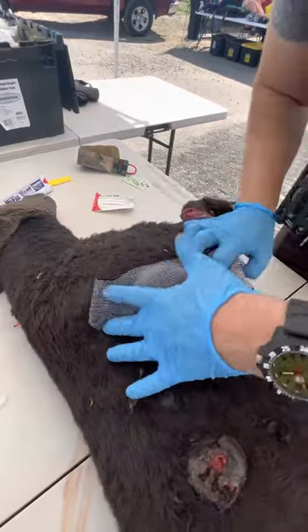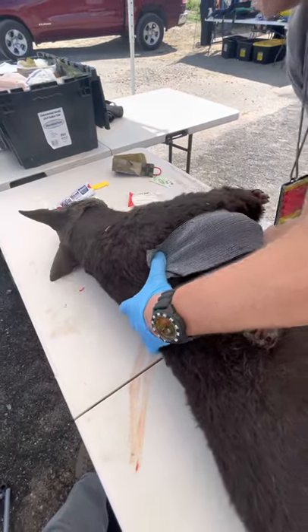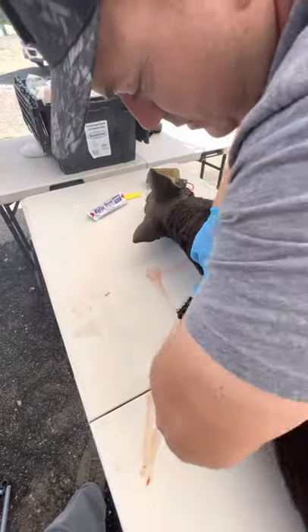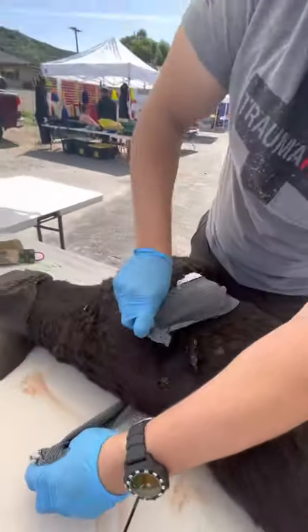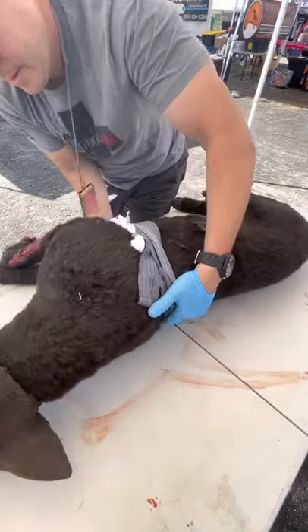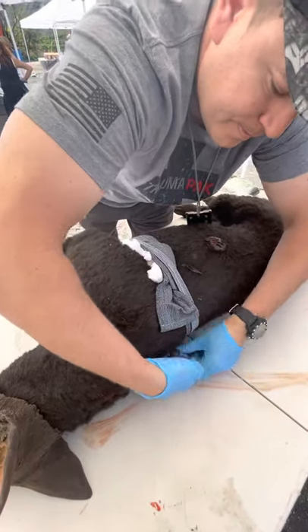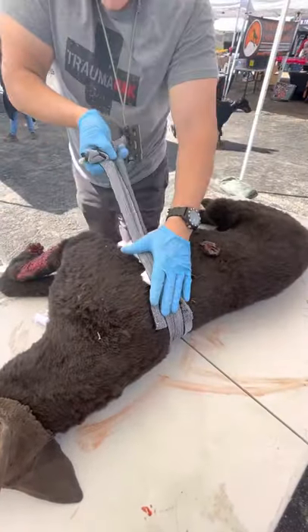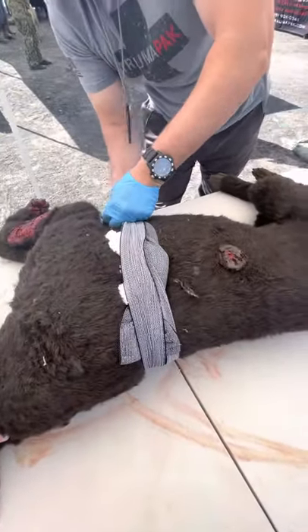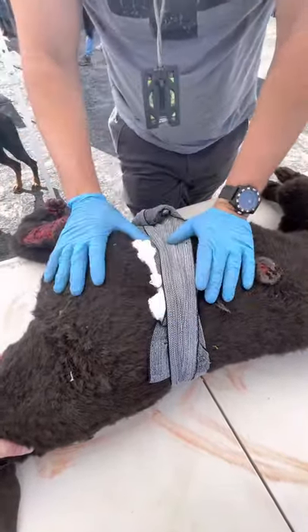Now go ahead and wrap this — we want to get nice and tight over this. This dog mannequin weighs about 70 to 80 pounds, so it's a pretty good simulation. As long as I've got enough pressure, I can finish it off with the bar here to secure it. We don't want to go too tight on this one because that's going to affect movement of respirations and so forth.